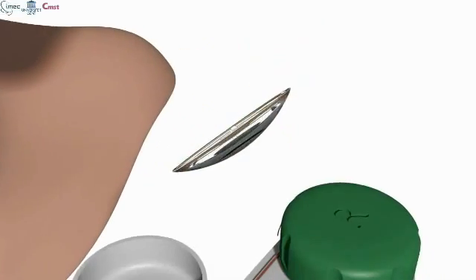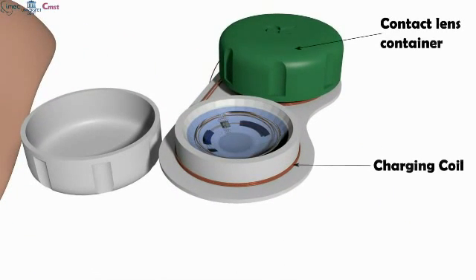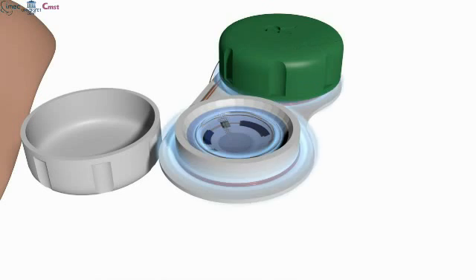In order to charge the lens, the user takes it out and sets it in the case. You can see here there's a coil around the outside of the cup, and RF induction charging is used between the coil on the lens and the coil on the cup.